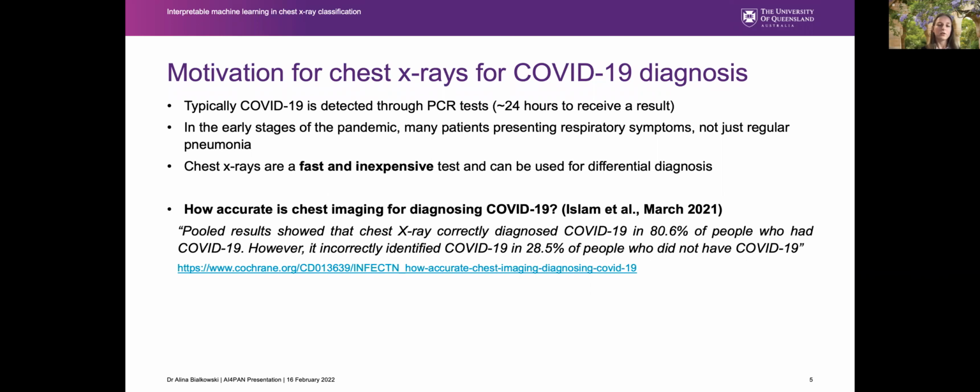So that's, I guess, reasonable sensitivity. However, it's not a perfect measure. So that's a little bit of a caveat behind whether we should use chest x-rays or not. But there was a little bit of motivation behind using that, especially in the early days, because it's something that's fast, inexpensive, and quite routine for people who present with respiratory symptoms.